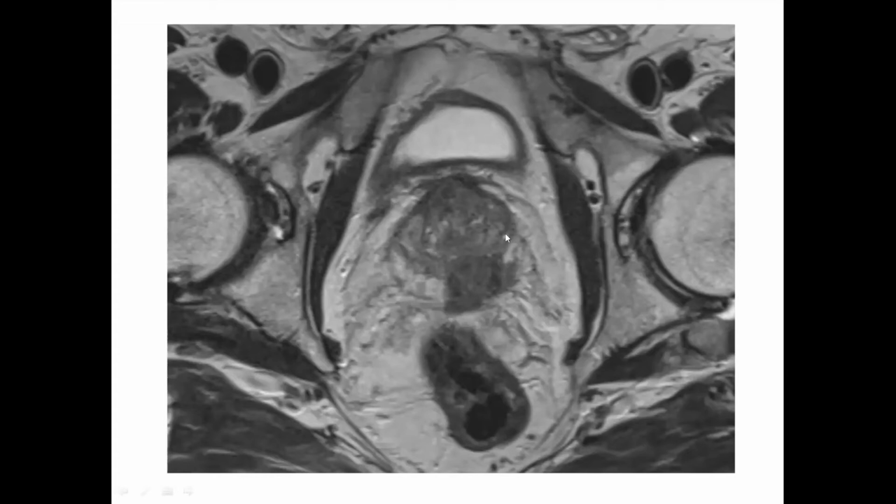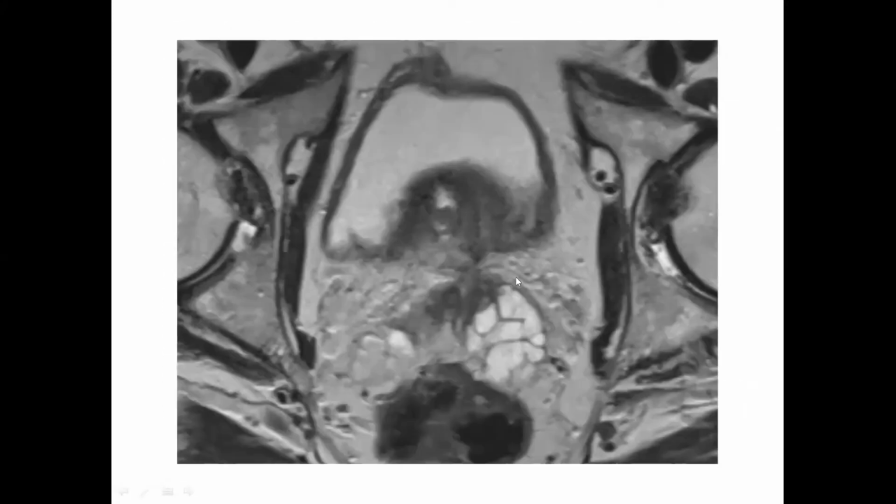So this is a slice through the pelvis. This is the prostate in the middle here. At the front, this white area is the beginning of the bladder, and at the back, the black area here is the rectum. So if we go up or down, there we go.